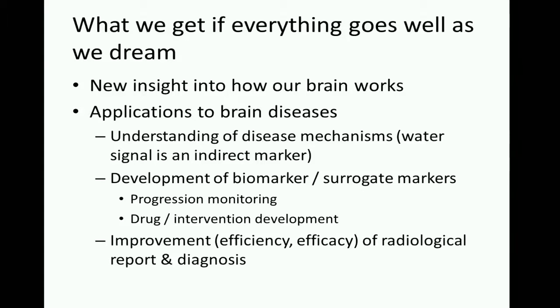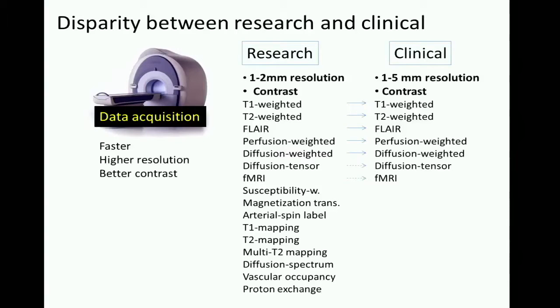I believe more than 90% of MRI scans done every day is this radiology. So I want to focus on this last part as a target of translational research today. And then I really have to think about this disparity between research and clinical MRI.